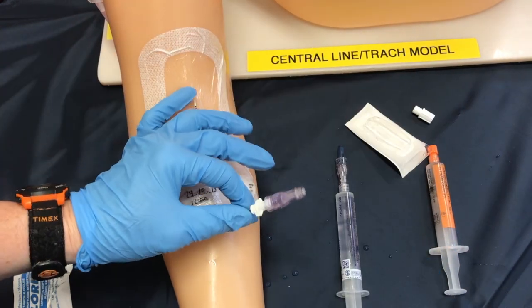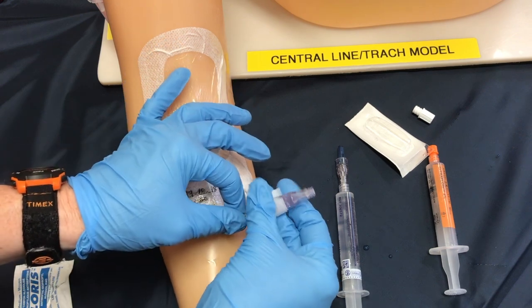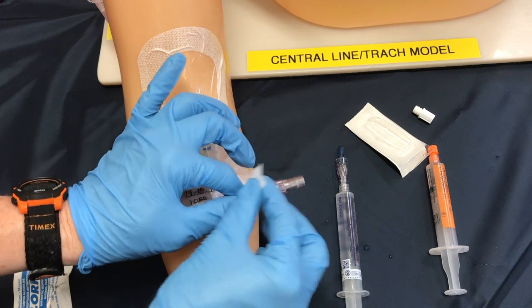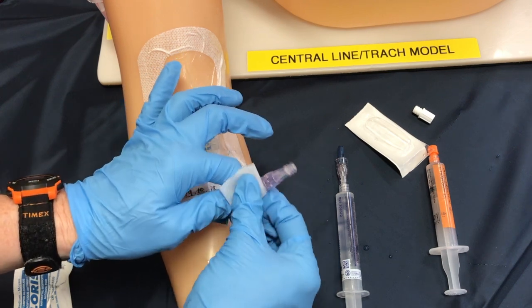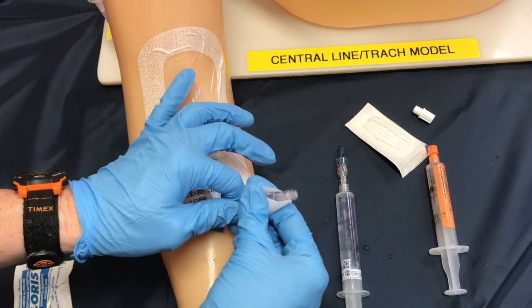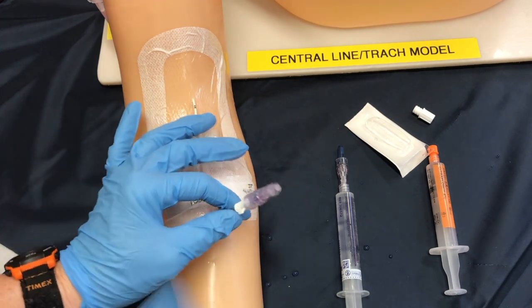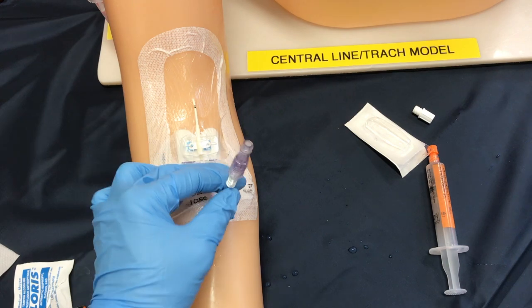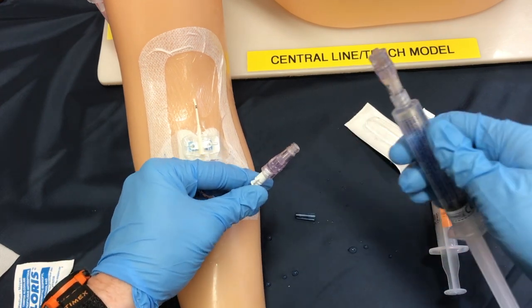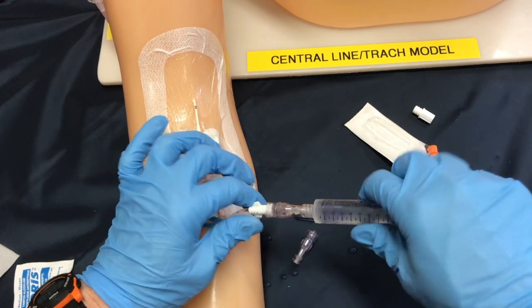If you guessed a 15-second scrub, you would be correct — but this time we're going to focus a little lower and actually cleanse the area where the cap will detach from the catheter. Again, a good 15-second scrub here; use some friction to get rid of any bacteria. Once that's done, let this air dry. Then I'm going to gather my syringe that has the cap attached, remove the sterile blue end, and keeping this end sterile, use my thumb and index finger to remove the old cap and simply screw on the new cap.